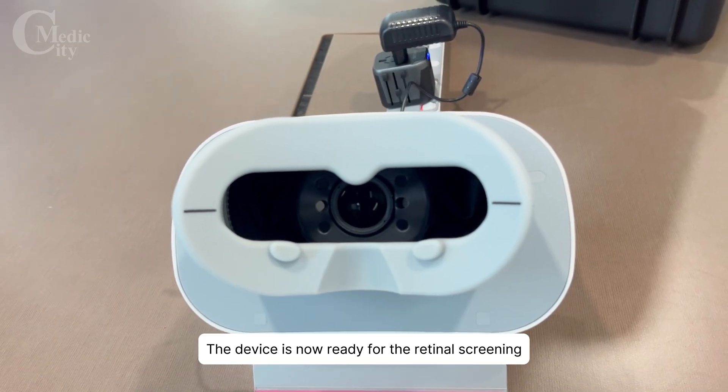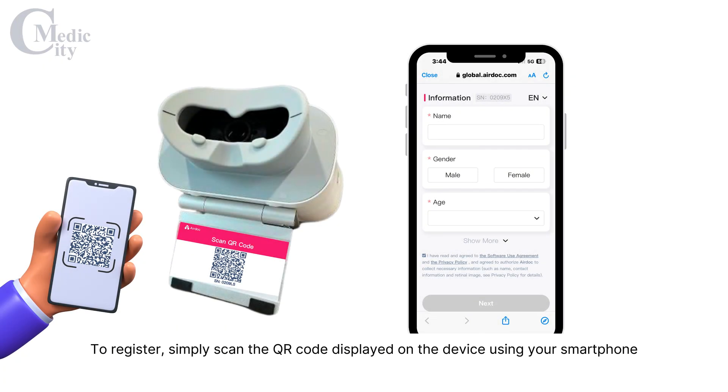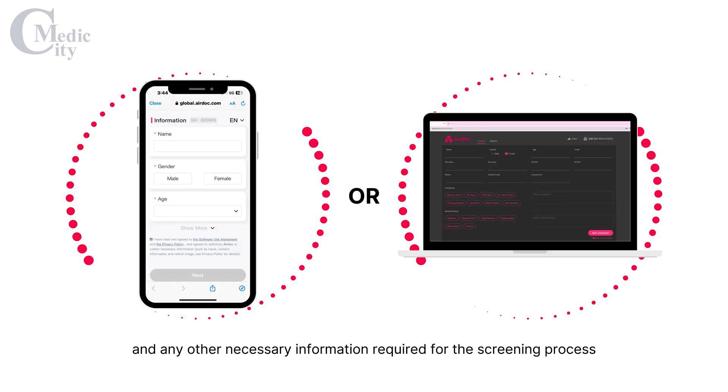The device is now ready for the retinal screening. Let's begin with registration for the screening process. To register, simply scan the QR code displayed on the device using your smartphone, or sign in at the AirDoc web portal using the designated username and password provided for the AirDoc system. Input the patient details and any other necessary information required for the screening process.